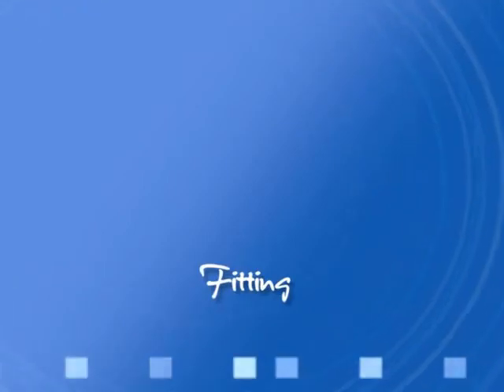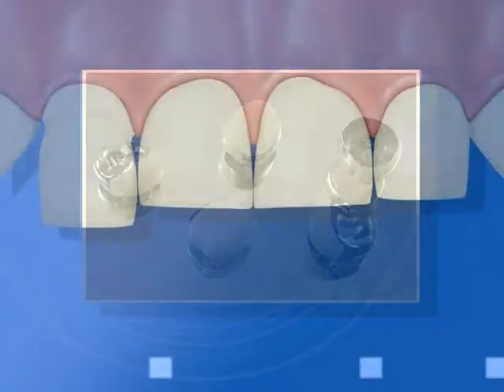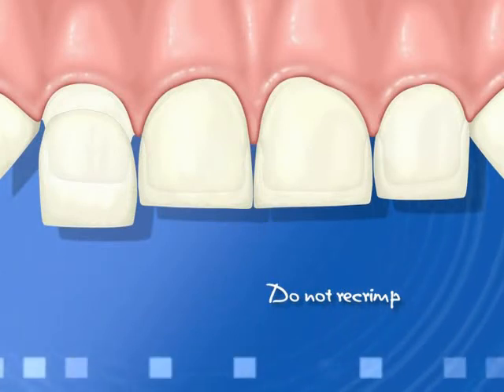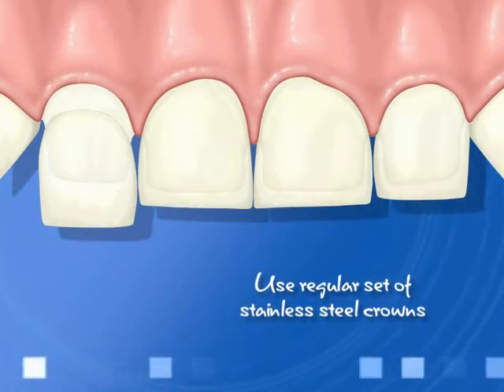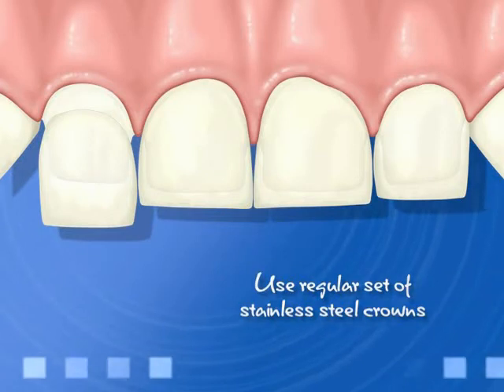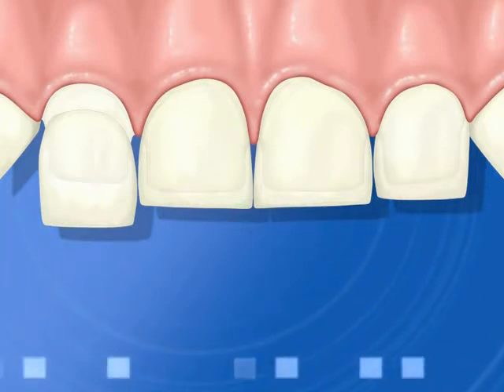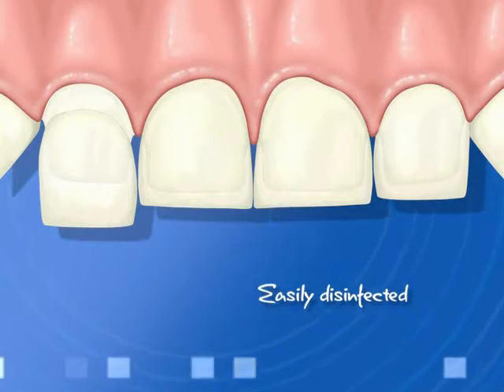Fitting. Probably the most important part of using Kinder crowns is selecting the right size crown. The facial has been pre-crimped before applying the facing, and it cannot be re-crimped. We recommend that you use a regular set of stainless steel crowns to choose the correct size and for tooth reduction guides. This will give you an approximation of reduction needed and will help eliminate stress from flexing of the composite facing. Stainless steel crowns are also easily disinfected.